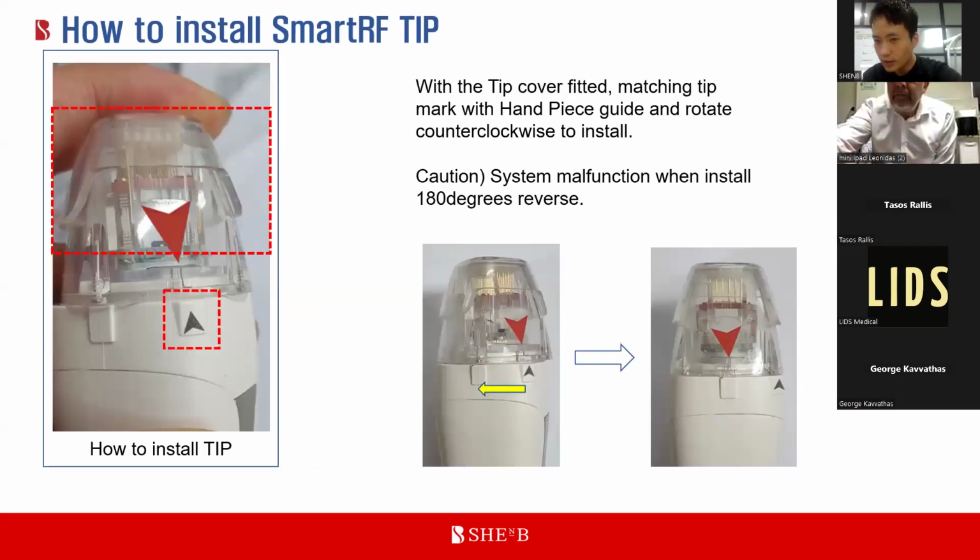So far, do you have any other inquiries about the tips? Yes, Steve, I would like to ask you something. When we change the tip, since we have those pins that transfer data signals, do we have to switch the system off, or doesn't it matter? Doesn't matter. When we change the tip, it doesn't matter. No.